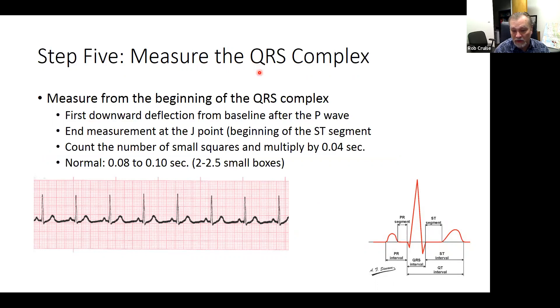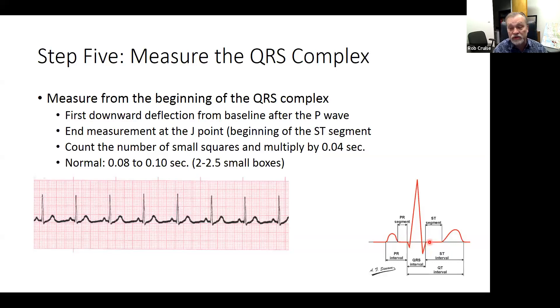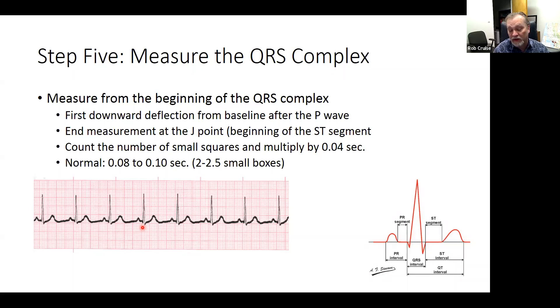Step five: measure the QRS complex. We know that if the QRS complex is wider than normal, there is a pathology. You measure from the first downward deflection, starting your caliper there and measuring all the way up to the J point, which is where the QRS complex returns to baseline. Normally you want 0.08 to 0.10 seconds, which is two to two-and-a-half small boxes. Anything different from that is an indication of pathology that we'll get into in later lectures.